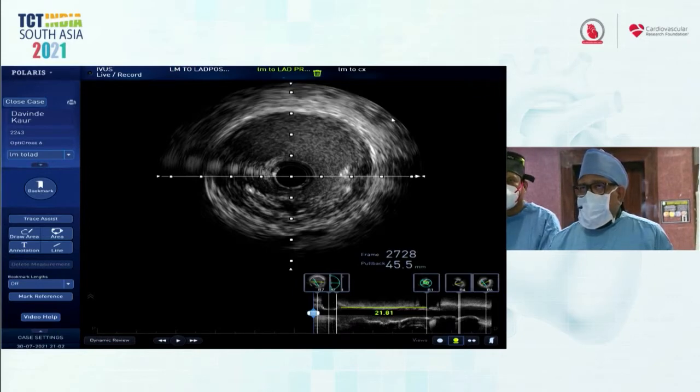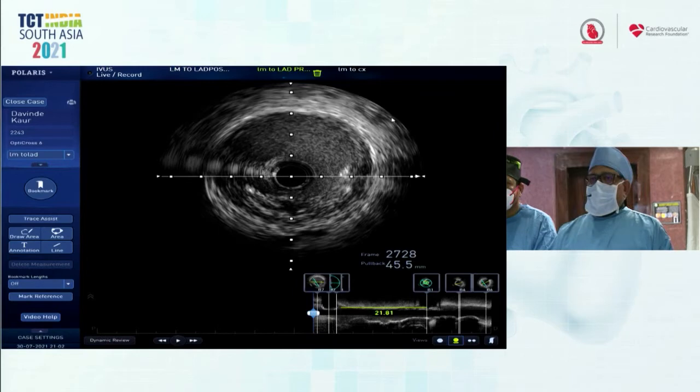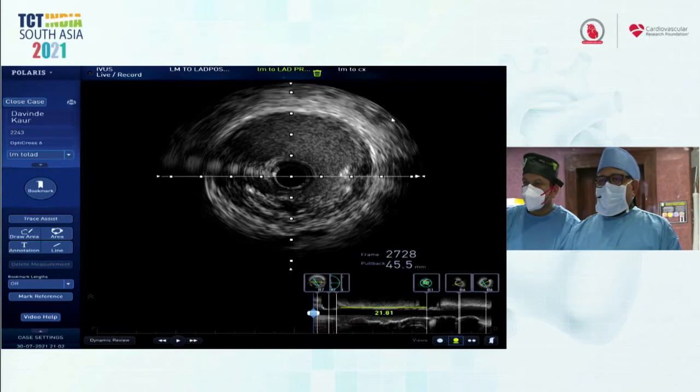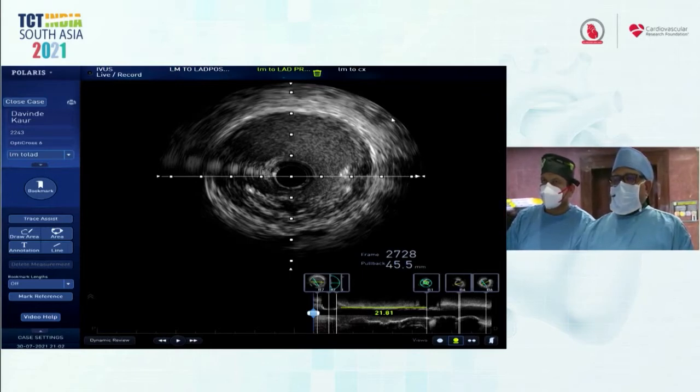It's a little different if you are saying, well, I have a lesion that I have to stent. Do I use 1 or 2 stents? Can I stent from the left main into the circumflex and leave the LAD alone? Can I stent from the left main to the LAD and leave the circumflex alone? Those are different situations, because whether or not you want to admit it, you are affecting the non-stented vessel.